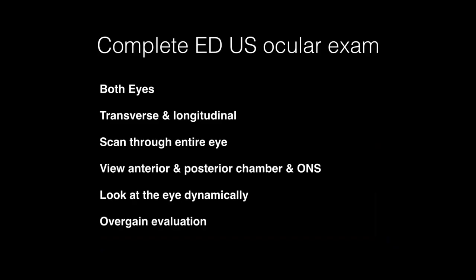So what does a complete exam entail? It entails looking at both eyes. It entails looking at both a transverse and longitudinal view. I admit I'm not the best at looking at both eyes. I tend to go right to the one that's having issues. However, in good practice, especially if you're learning, I'd want you to look at both eyes and make sure you scan through the entire eye. So make sure you fan all the way in the longitudinal and transverse planes so you can get the entire view of the retina and the posterior part of the eye.